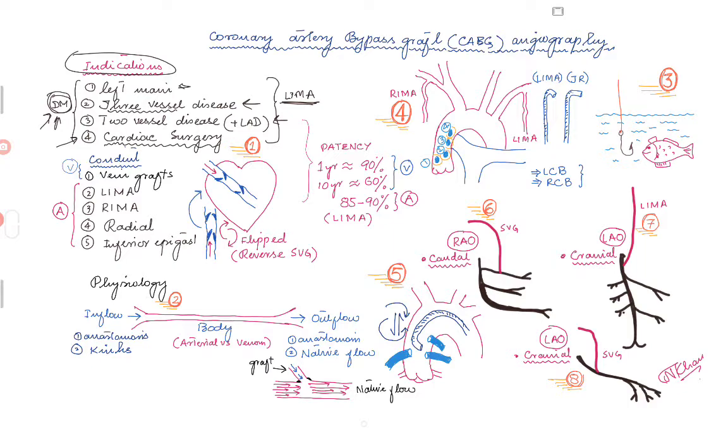femoral arterial disease, ischemic limbs. They might have subclavian stenosis, all the peripheral vascular disease you can think of. But when you look at their LIMA, for some reason the LIMA will be pristine. It is something about the LIMA that it never gets any plaque. It's got good flow, and that makes it the most preferred conduit or bypass, and that's why they always put it on the LAD.